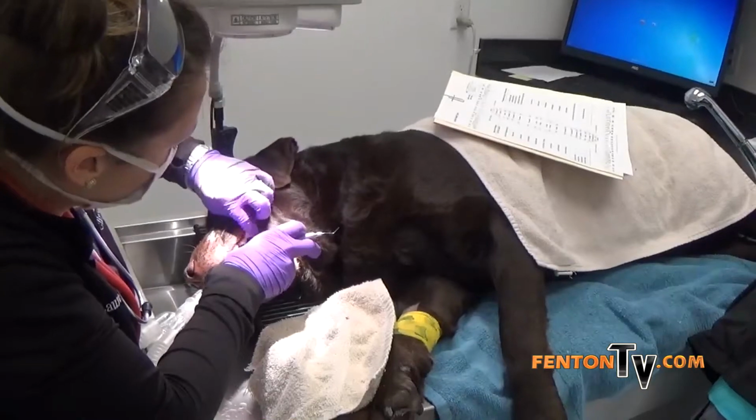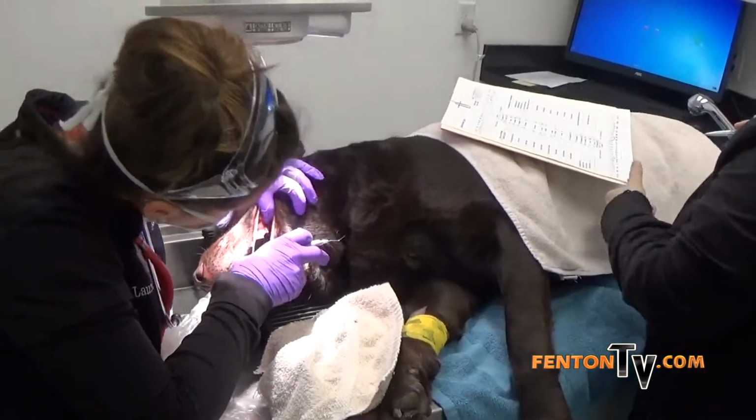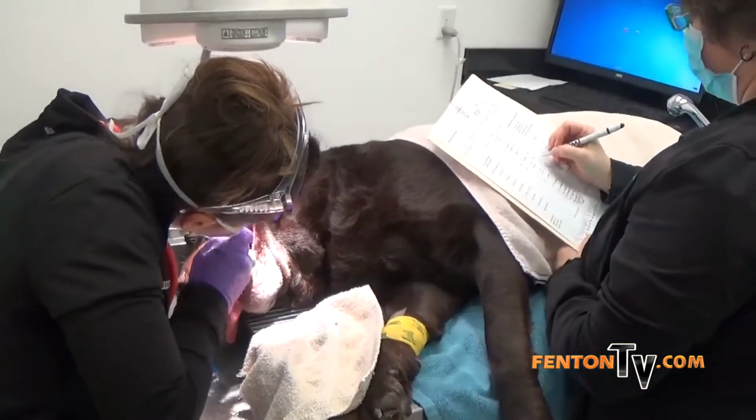Where are you starting? I'm starting left top all the way to the back.